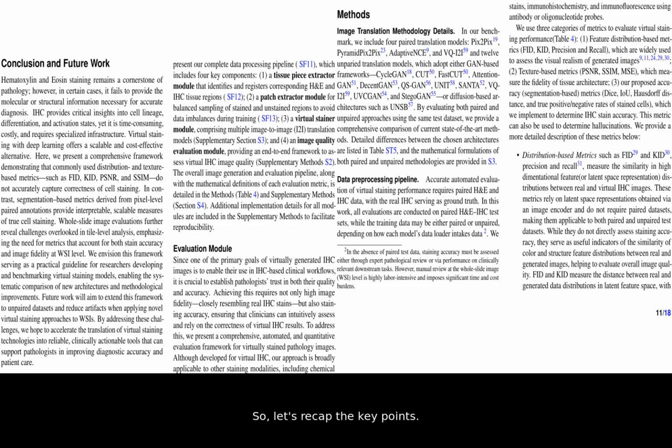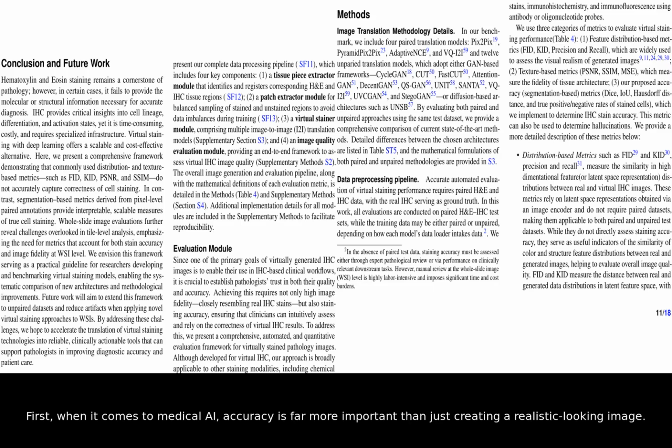So, let's recap the key points. First, when it comes to medical AI, accuracy is far more important than just creating a realistic-looking image. Second, the standard metrics we use for AI images are not good enough to measure this medical accuracy.